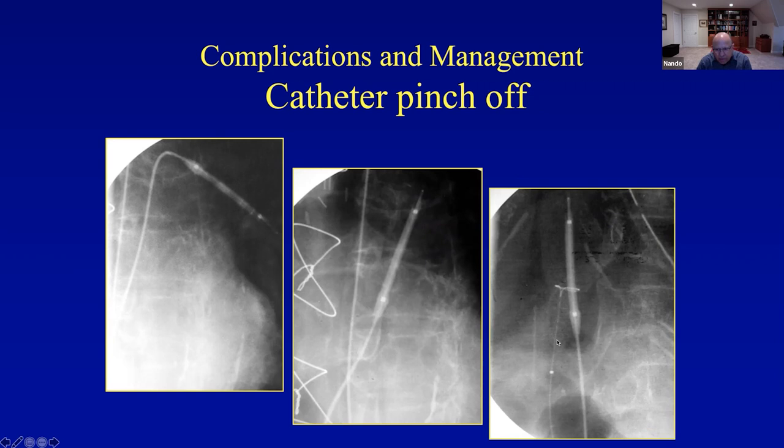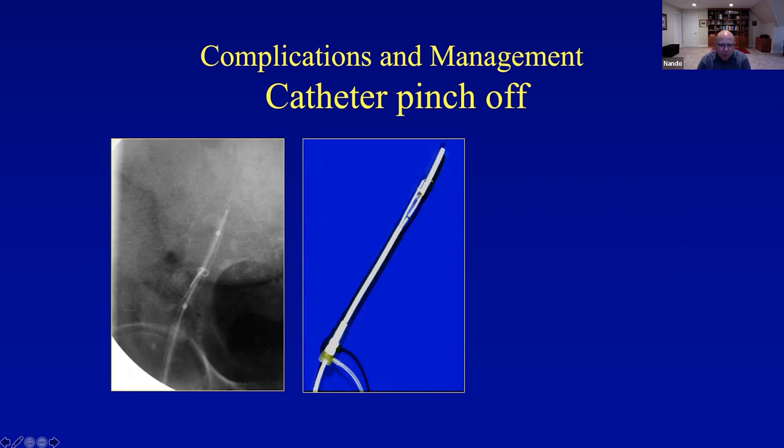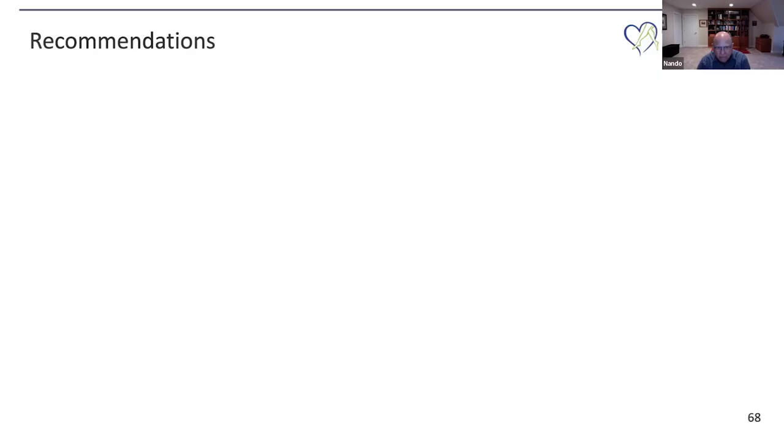At some point, I would have to pull the fragment through my access sheath and deflate the balloon. So I put in a snare to bind down the fragment and successfully pulled out the catheter. It was quite a fun case. Again, a nerve-wracking case, but imaging allowed me to resolve the clinical dilemma.